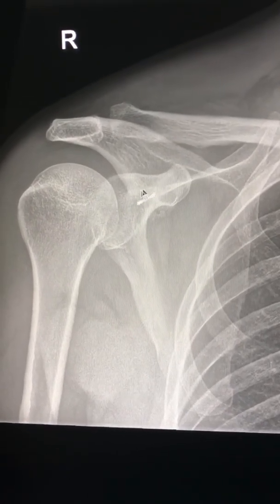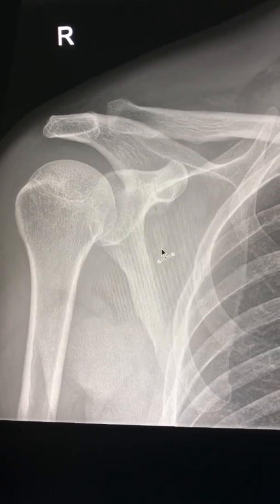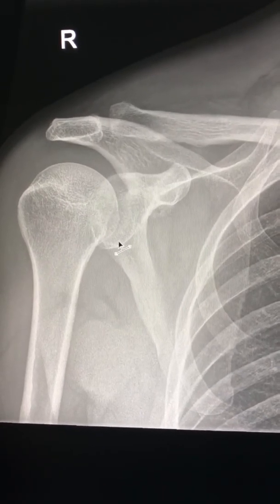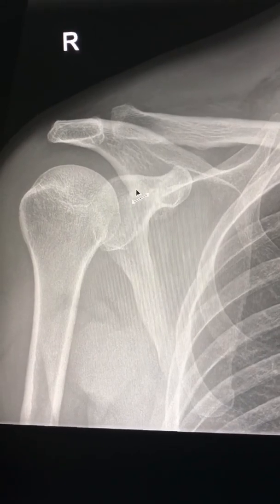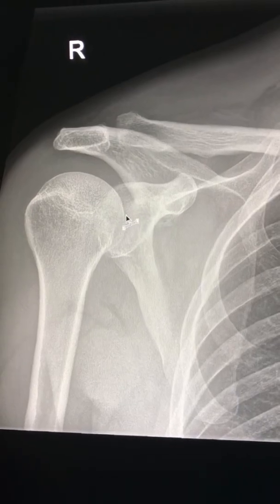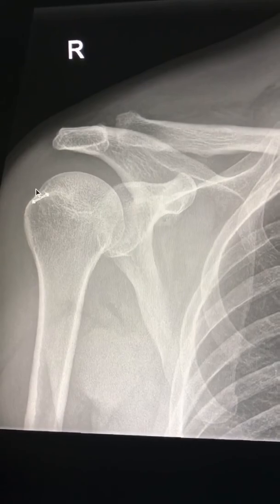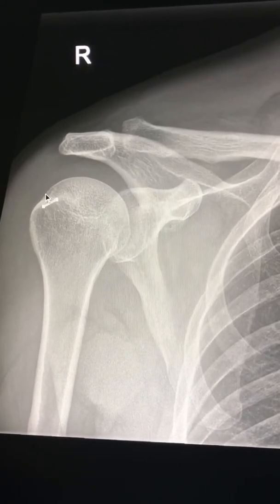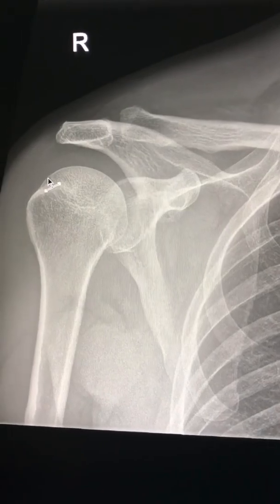After assessing for dislocations, if there is an anterior dislocation, don't forget to look at the glenoid rim for a Bankart fracture, which is mainly at the lower margin. Also look for the Hill-Sachs bone injury, which is mainly at the posterolateral aspect of the humeral head.